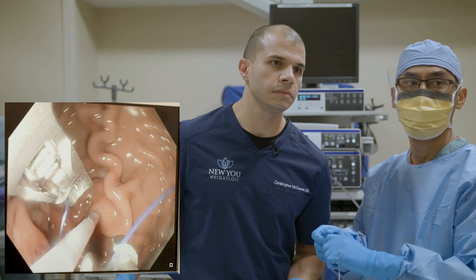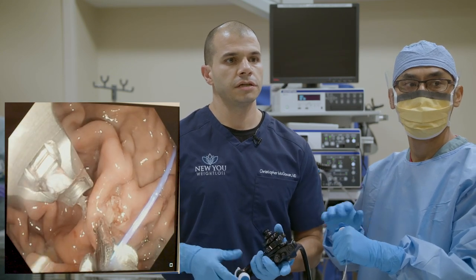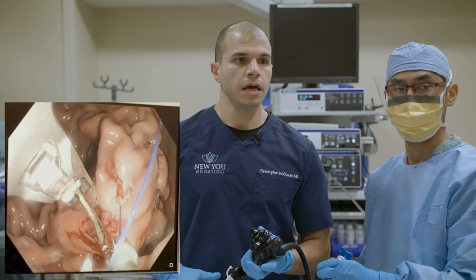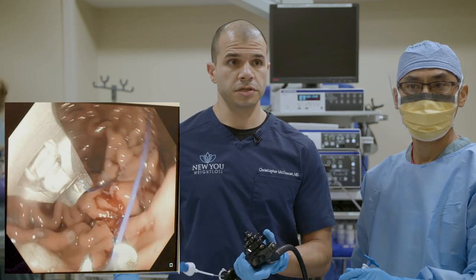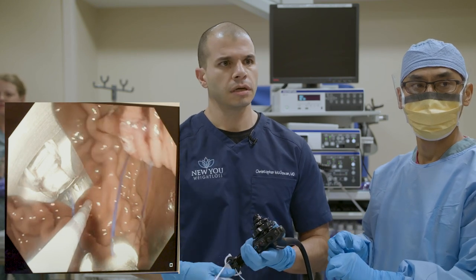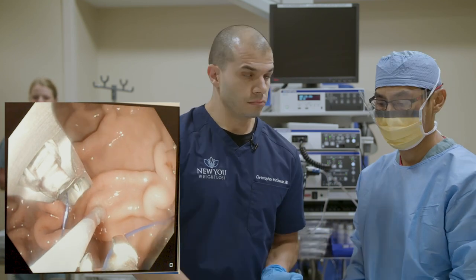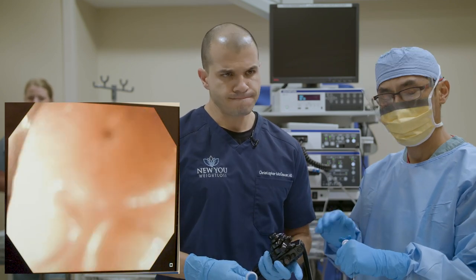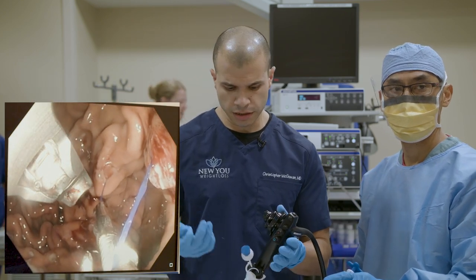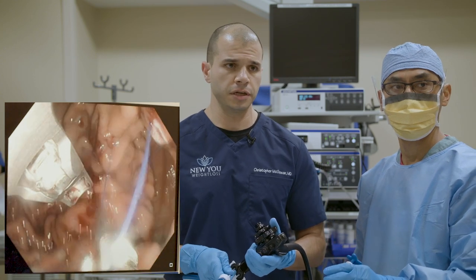Question: how does ESG differ from a surgical sleeve gastrectomy? The main similarity is that both are restrictive procedures — we're reducing the size of the stomach with no malabsorption component like a gastric bypass. The big difference is we're working through the mouth, not through the abdominal wall, and the recovery is much faster. On expected weight loss, published data shows 15%–20% body weight loss, though ours may be a bit higher. The final stomach shape also differs — a surgical sleeve staples off the stomach into a long banana shape, while with ESG we shorten and narrow it so it bunches up tight.